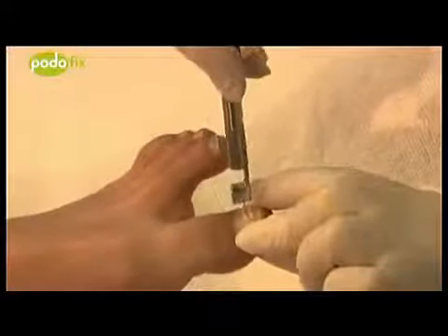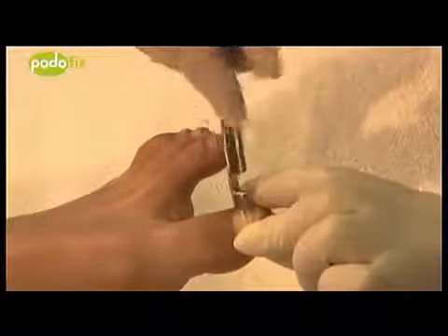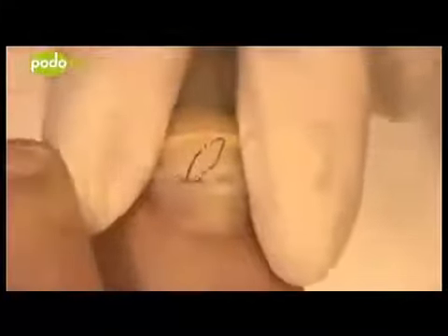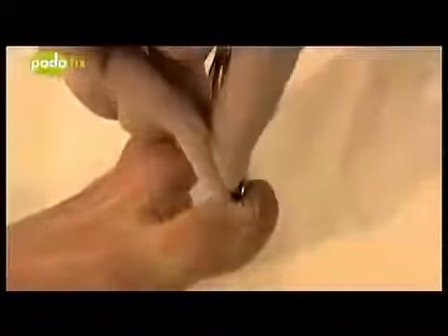Place the tension instrument into the wire loop. Turn at least once and a maximum of two complete turns until the desired tension is attained — you can determine the force required by asking the patient. Then press the tension instrument lightly down in order to push the wire into the recess. Use the side cutter to cut the wire loop by laying the cutter flat on the brace and cutting the wire loop with a cut parallel to the loop.